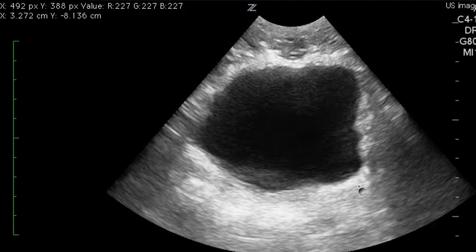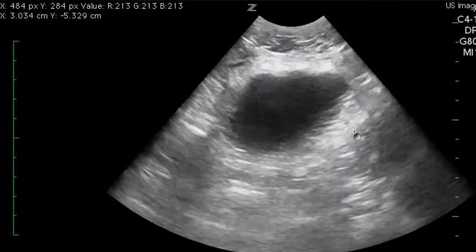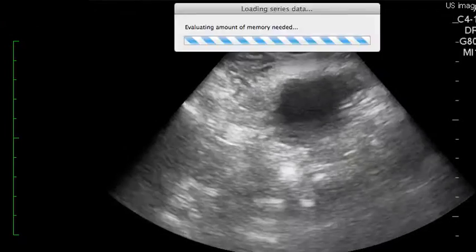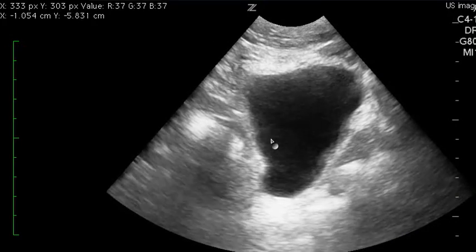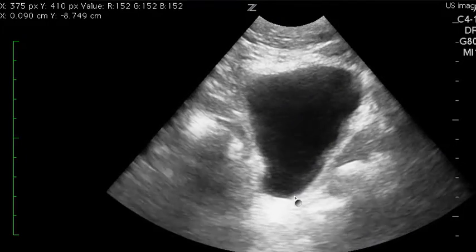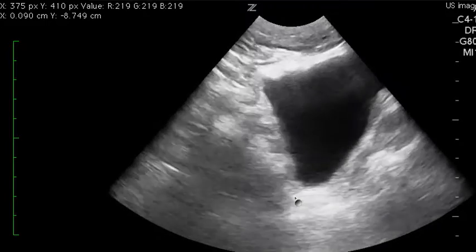Your suprapubic I really like because you see how you make the organ disappear, so you're clearly moving the probe or fanning to get the whole three-dimensional structure. And then you turn the probe 90 degrees, which is great, and you make it disappear. So you're definitely moving the probe with the suprapubic. So do this with the right and left upper quadrant, just so you can see the entire organ.